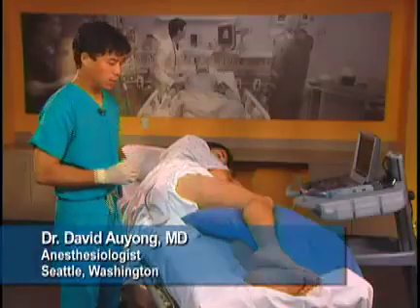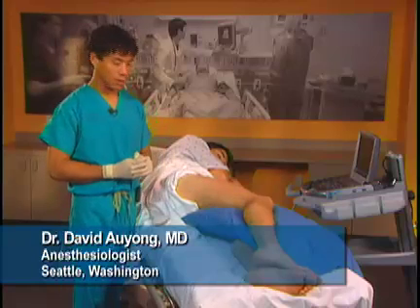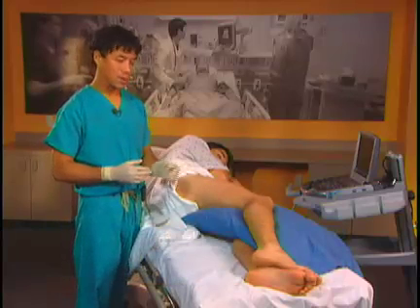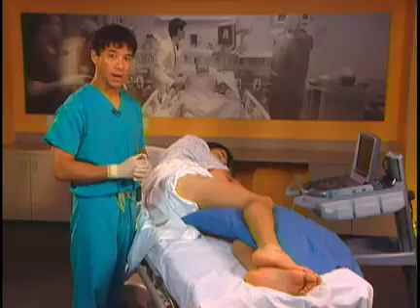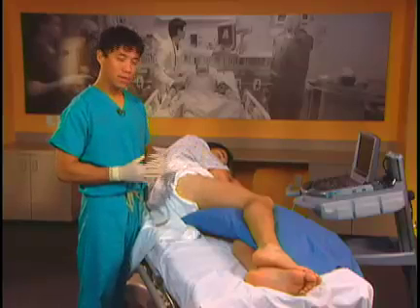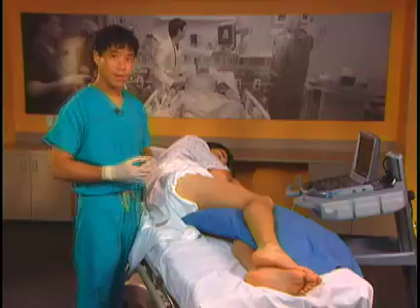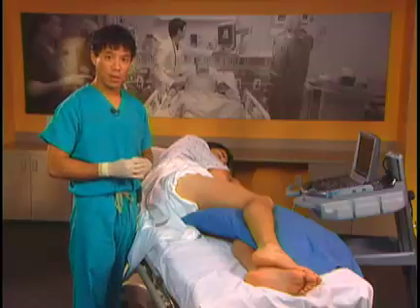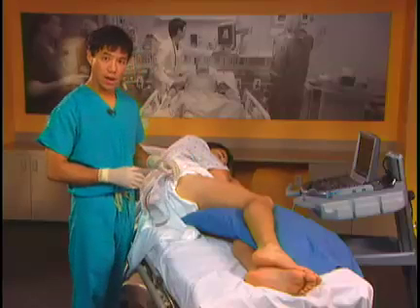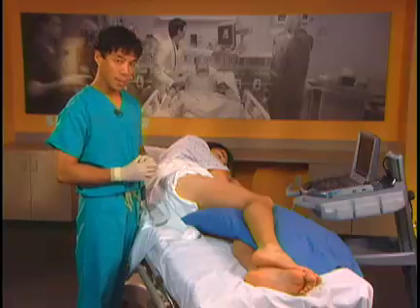The sciatic nerve block can be used for surgery of the leg, knee, foot, and ankle. You can block it at the popliteal region or higher. Some benefits of blocking it higher are to be above the tourniquet, so you don't have to worry as much about nerve ischemia. You may also get the posterior femoral cutaneous nerve of the thigh, which comes off very high on the sciatic nerve and is also medial to it.